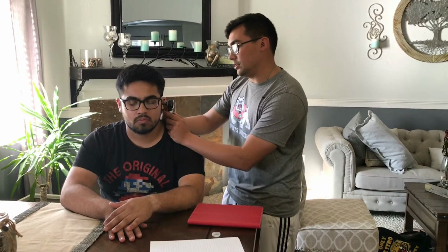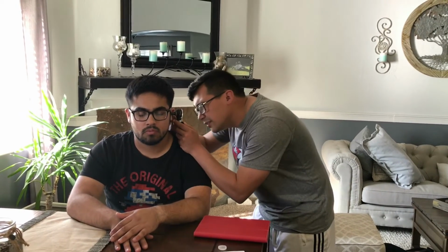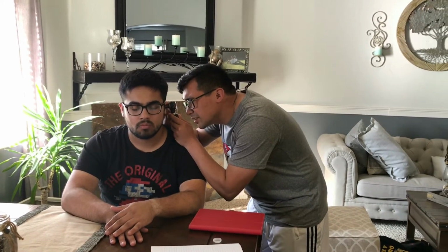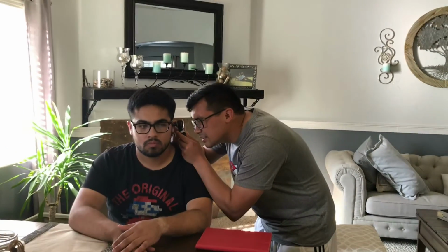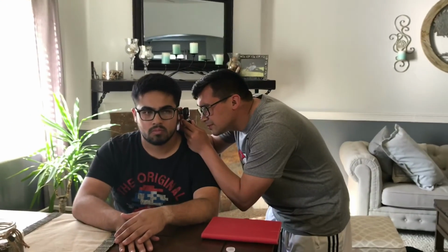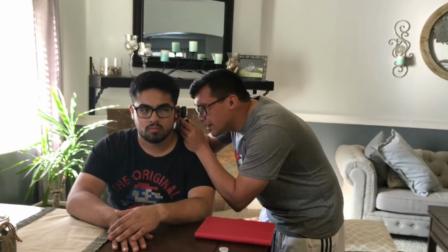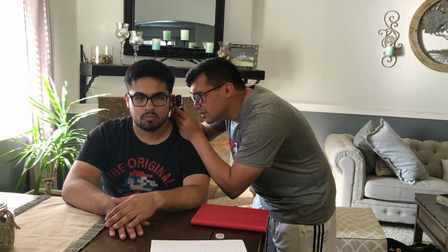So I'm just going to stick the otoscope inside and put on the light. And then I'm just going to look through Michael's ear canal. He has some earwax, but it looks like it's nothing excessive. And he has no white spots in the back. I don't see any holes in his tympanic membrane. So just based on the evaluation of his ear, I'd say it's pretty normal. So yeah.